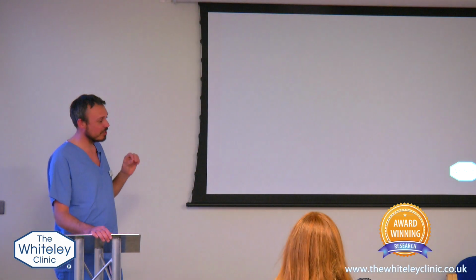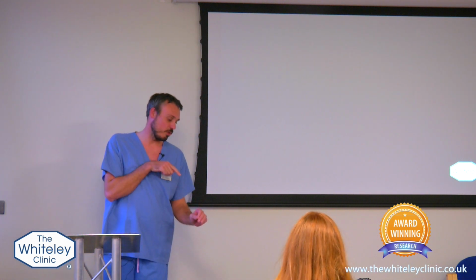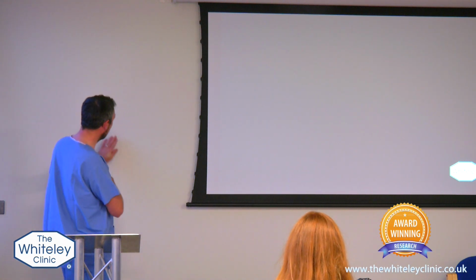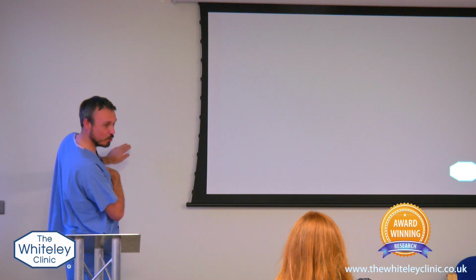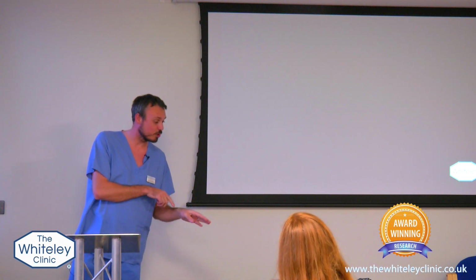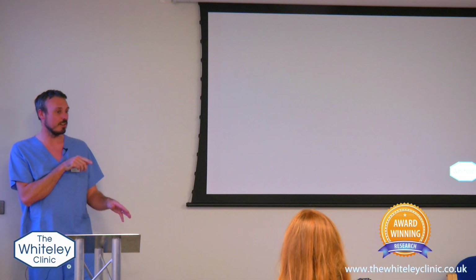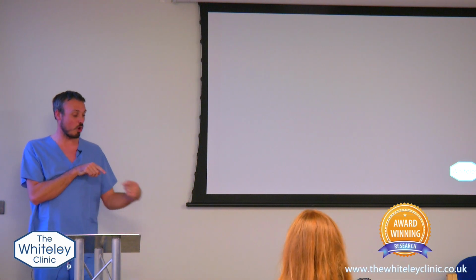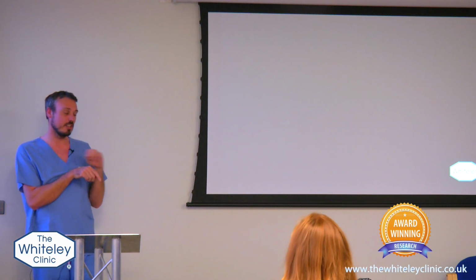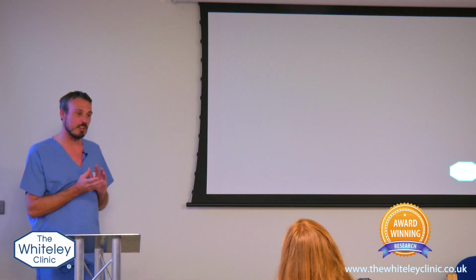The other thing that it allows me is that sometimes as you're pushing the coil out, if you meet resistance, it pushes the catheter back. So it's like me just pushing a wall like this. If I put my hand like this, it pushes me back. Sometimes you can be in the best position in the world, and as you push the coil out, it pushes the catheter back, and then you lose that position. But because this coil is actually part of the wire, until you fully deploy it, you can simply push the catheter back over the coil. So it allows for really nice tricks and techniques to use.